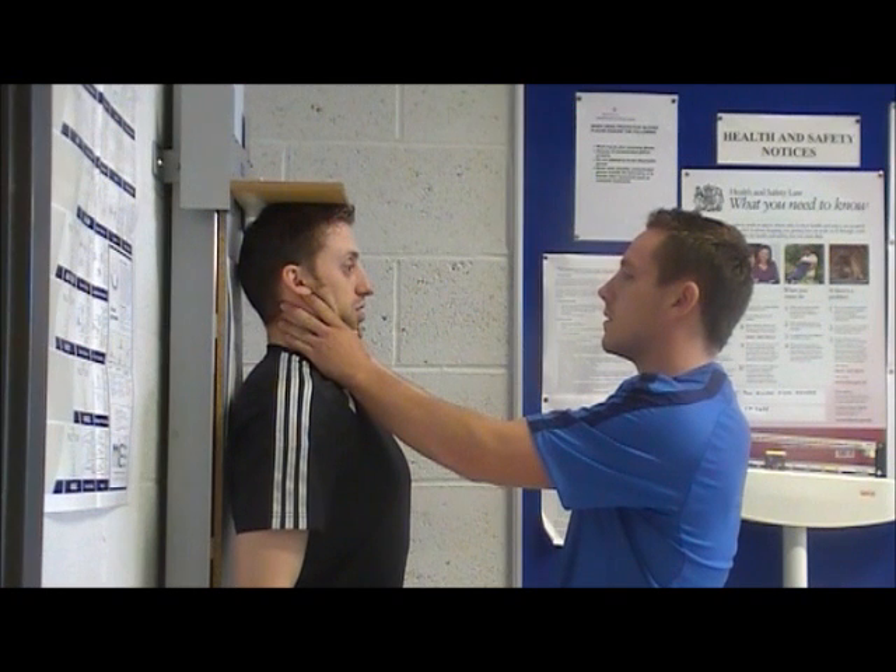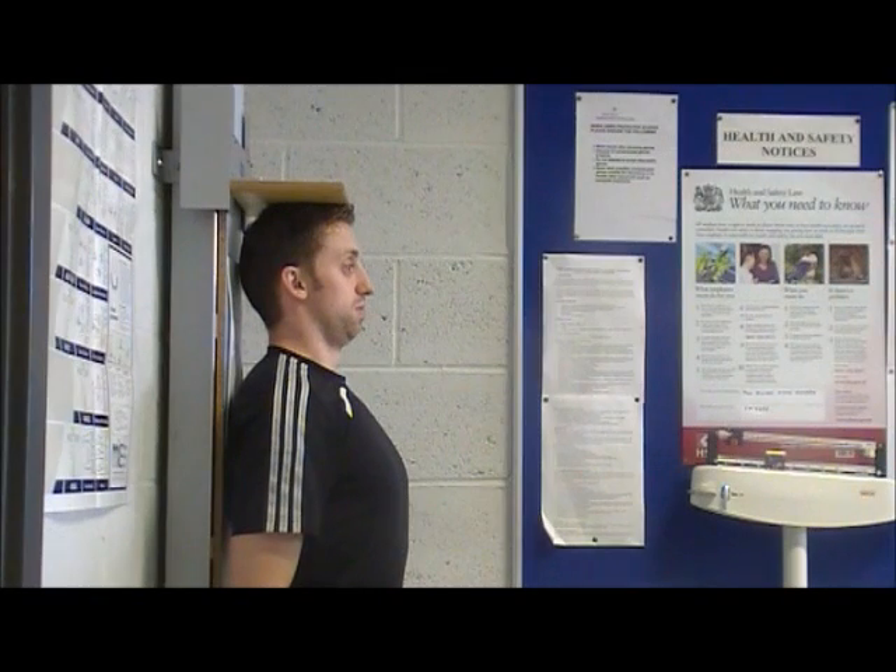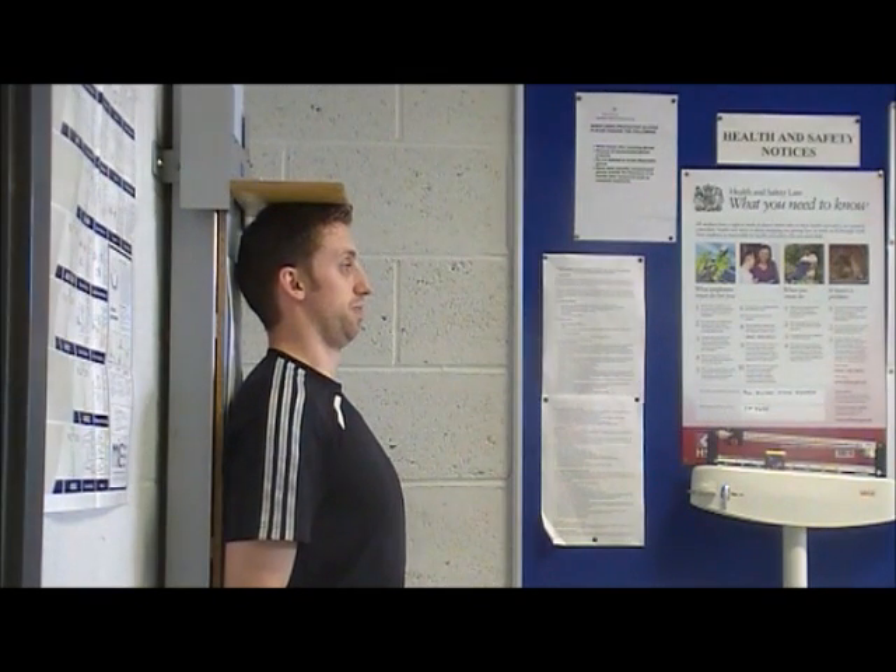Ask them to breathe in and gently lift them. Get them to breathe out and move away and read the measurement.